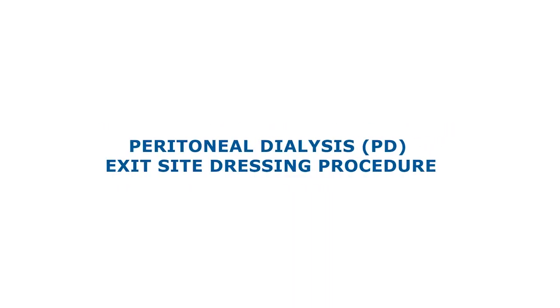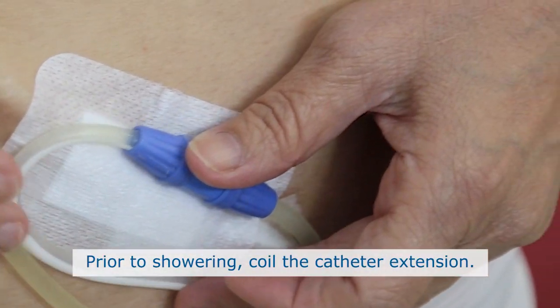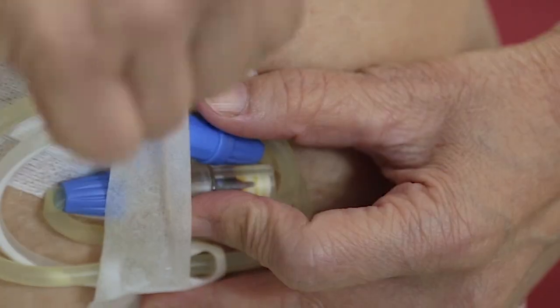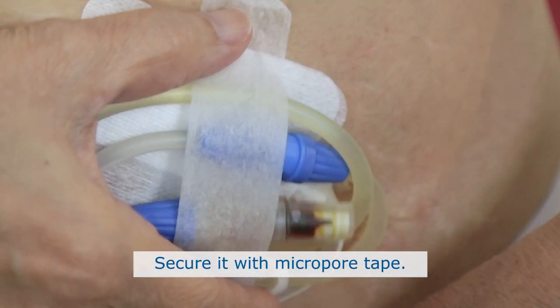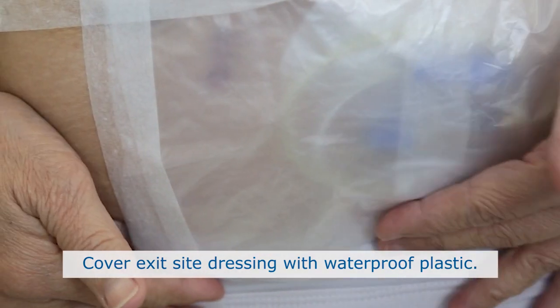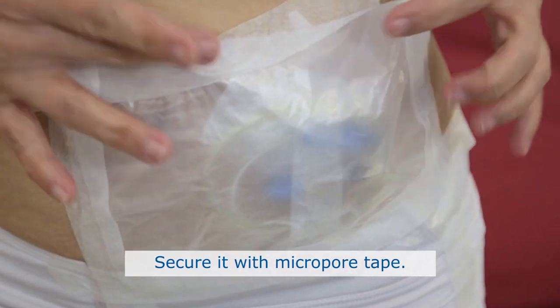Peritoneal Dialysis PD Exit Site Dressing Procedure. Step 1: Preparation before showering. Prior to showering, coil the catheter extension and secure it with micropore tape. Cover your exit site dressing with waterproof plastic and secure it with micropore tape.